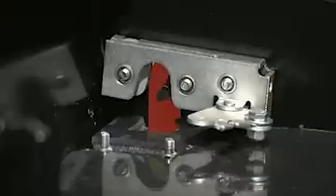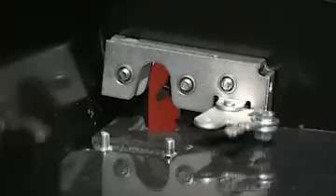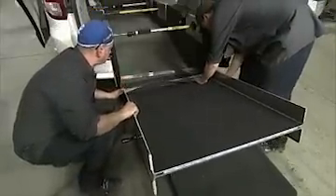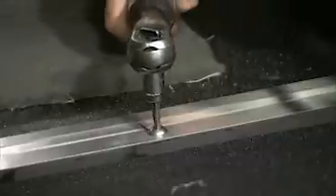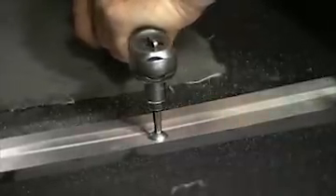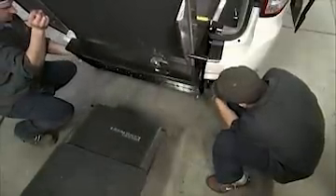He attaches a return spring to the handle assembly. He turns the handle and tests the latches to confirm that the mechanisms function properly. The team then links the wheelchair ramp to the new floor with a long hinge. They install stainless steel trim over the hinge to protect it, and also connect the counterbalance cables to the ramp.